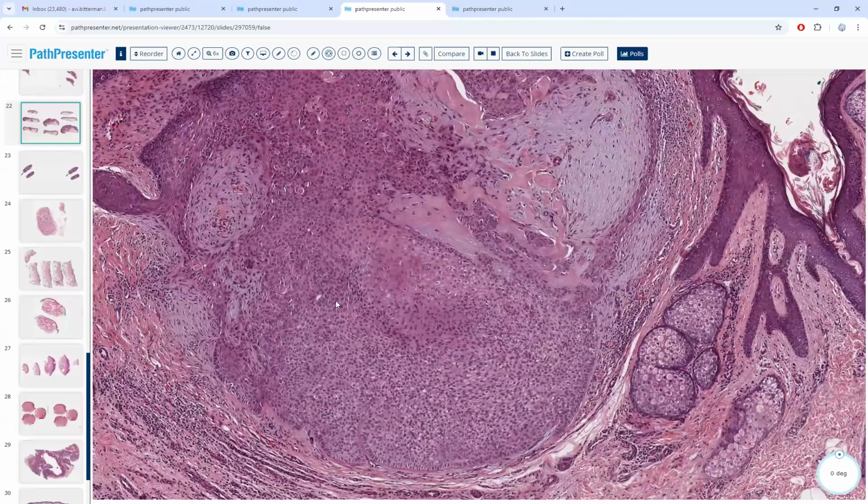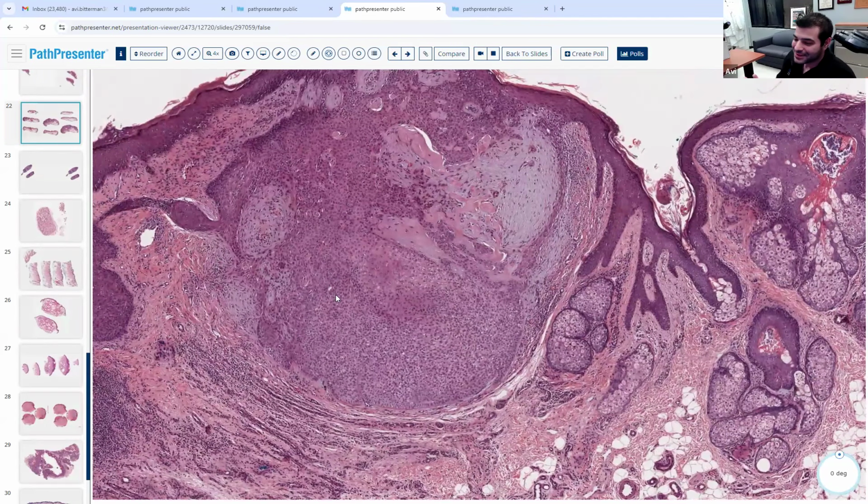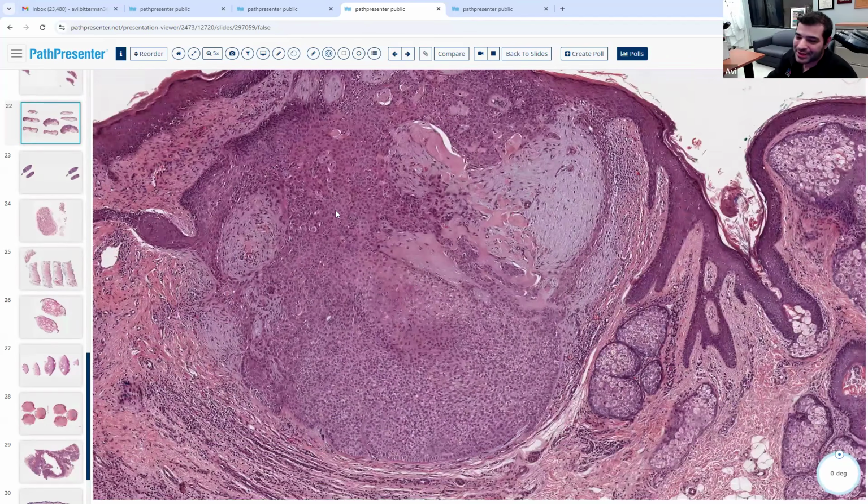But also, these are heuristics. So if we have something that's low in size, something that's well circumscribed, but the symmetry is a bit off, don't pull the gun on malignant. They're rules of thumb, and if you have 2 of the 3 rules of thumb going for benign and 1 going for malignant, you might look at some other features before we make a call on whether it's benign or malignant.